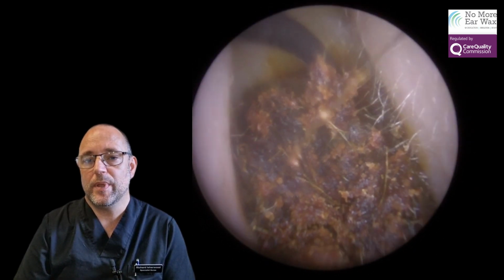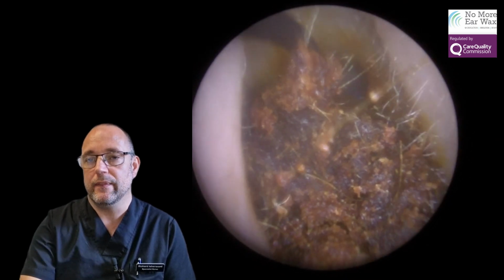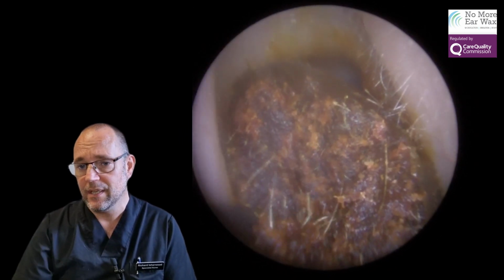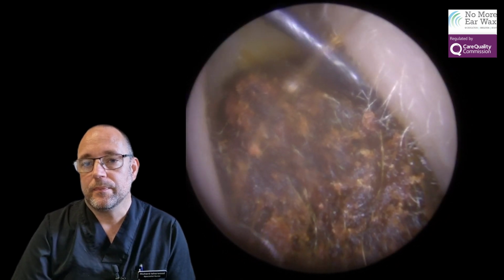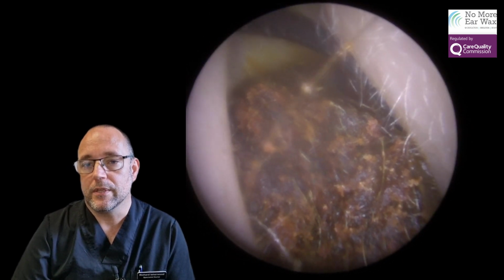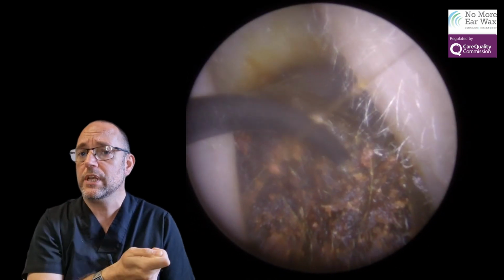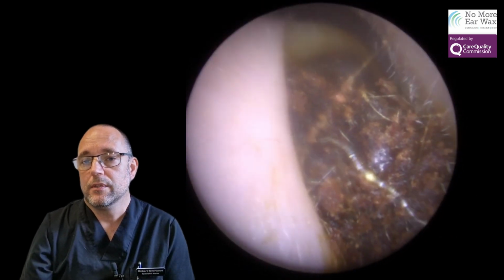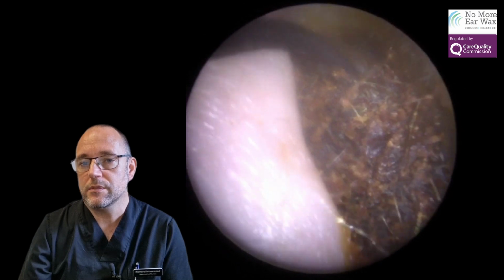But if I can get a bit more behind it, which I'm just trying to get in there now and embed it in the hard core of it, it should come forward. But again, you can see it's just slicing through it. So what I'm trying to do, there's a little gap there that we can see now. So I'm trying to get that behind it, then rotate the hook round to dig it right into the middle of the plug so we can pull it out. As you can see, it's really wanting to move forward.